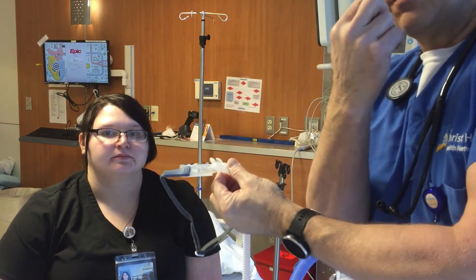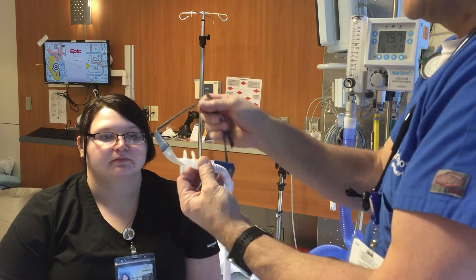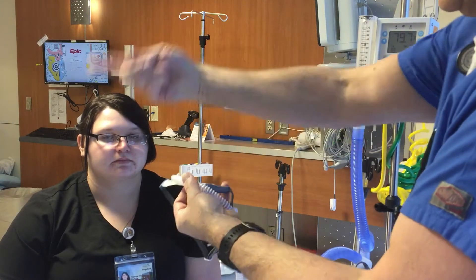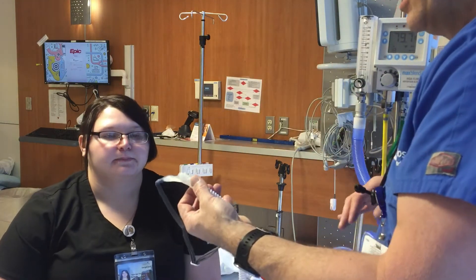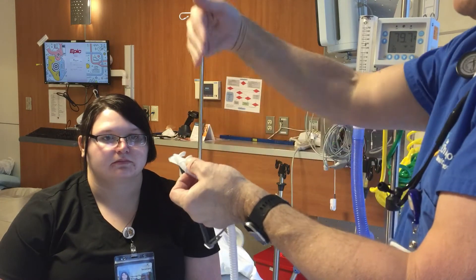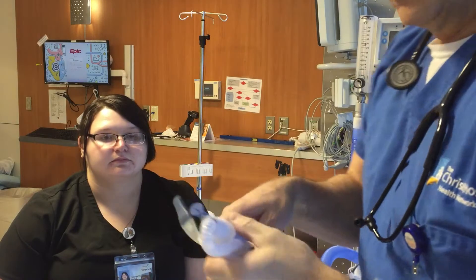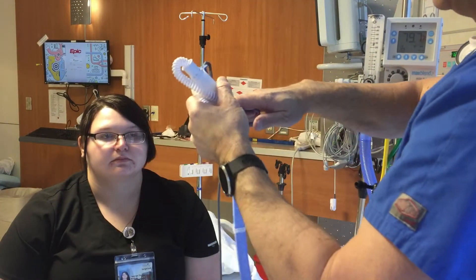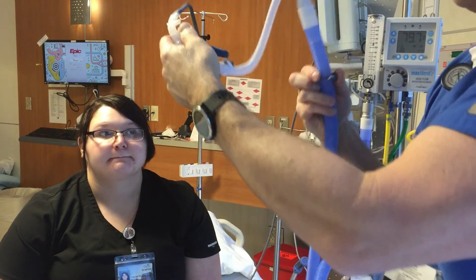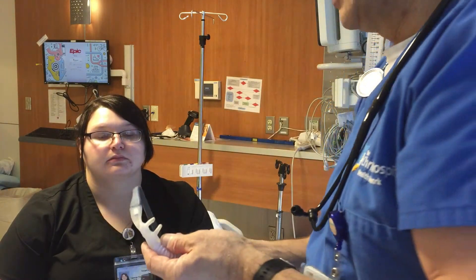These prongs are curved, so the curve goes down, and it has an elastic strap that goes over the head. If the hose is pulling to the wrong side, you can pop it out, flip it around, so it comes in from the other side. This tubing has some weight to it so it does tend to pull a little bit. They provide a small clip that you put on the large bore tubing and you can clip that to a pillow or bed sheet to keep it from pulling — because once the cannula comes out, they lose the pressure built by the extra flow.